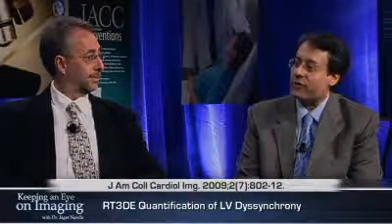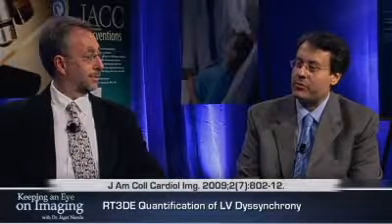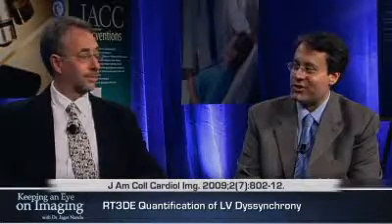I agree, and I think 3D has a very nice appeal in that it shows the areas that have the most delayed contraction, how close they are to the venous system. This data could be combined together, and even non-imaging cardiologists can appreciate its implications.